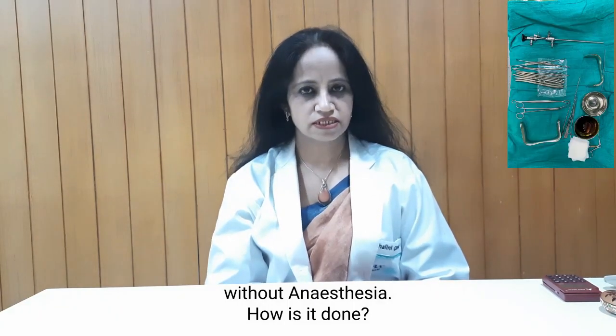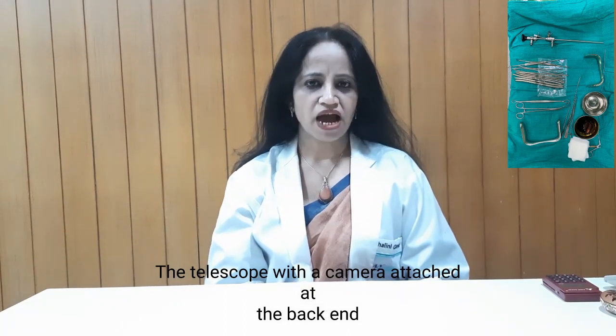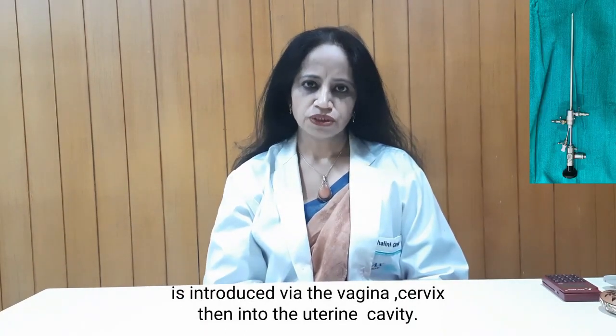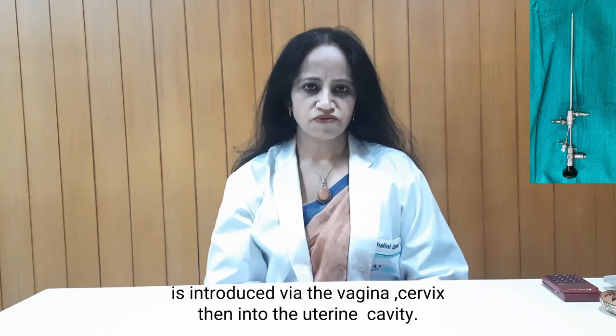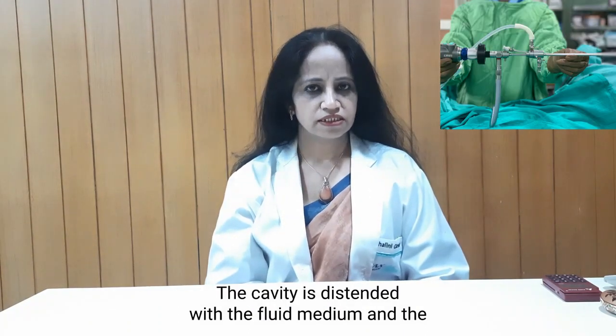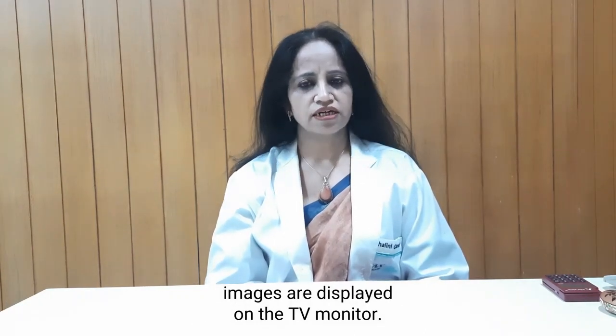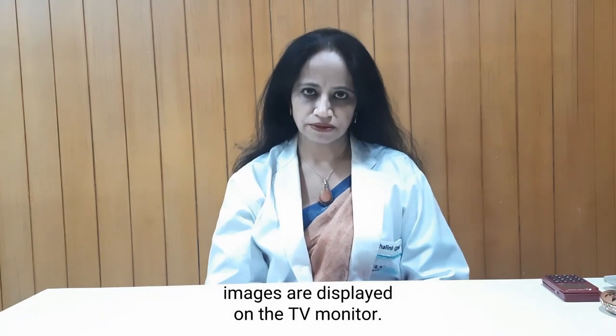And how is it done? The telescope with the camera attached at the back end is introduced via the vagina, cervix into the uterine cavity. The cavity is distended with the fluid medium and the images are displayed on the TV monitor.